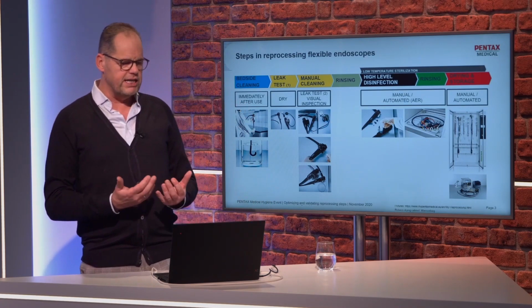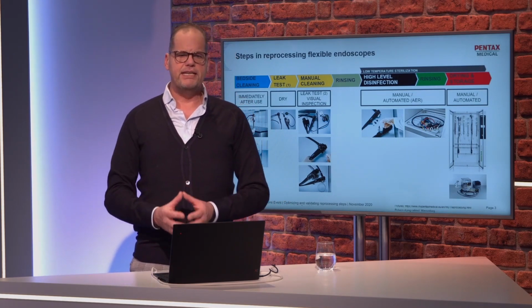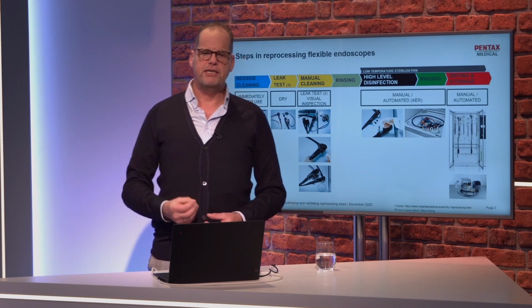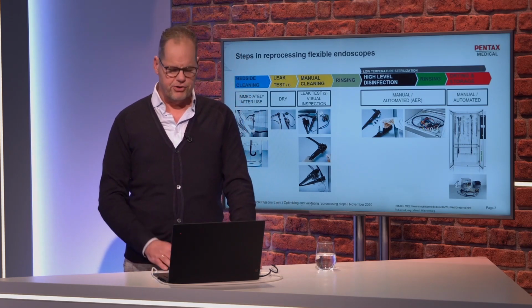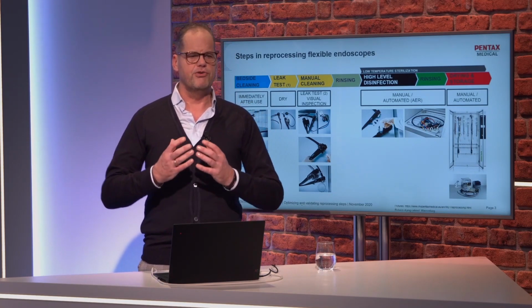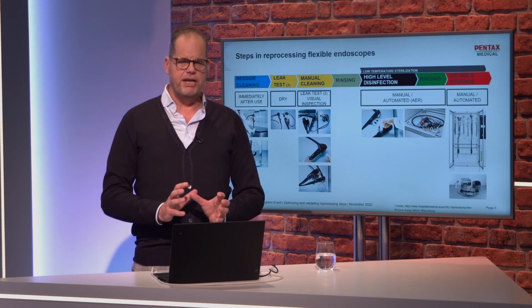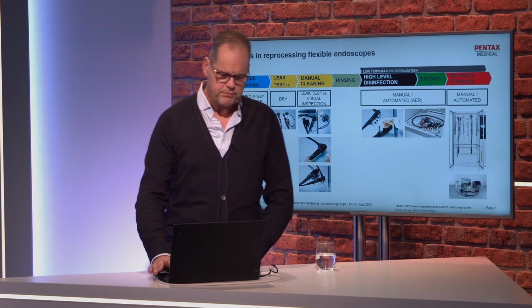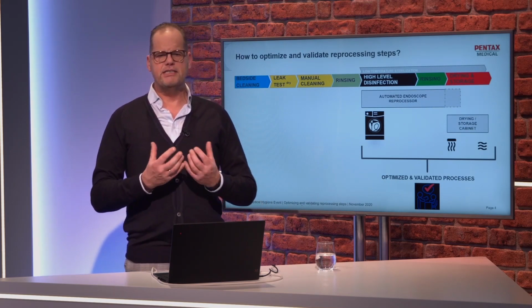Just to come back to the steps in reprocessing. We have the bedside cleaning, the leak test, the manual cleaning, the rinsing, the high-level disinfection. Again, a final rinsing, and then the drying and storage. We also already noted that all these steps are really, really important, and the bedside cleaning and the manual cleaning are the most important of it.